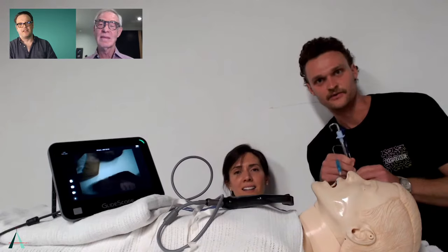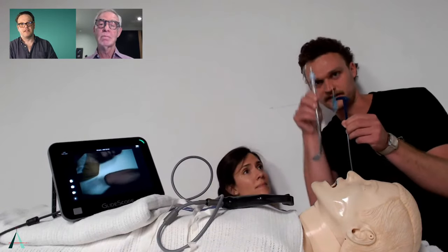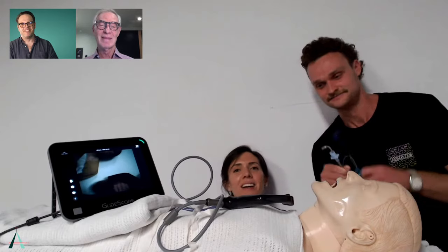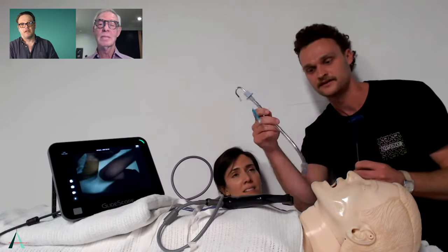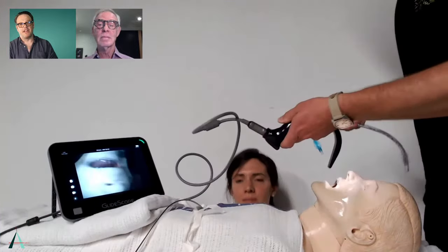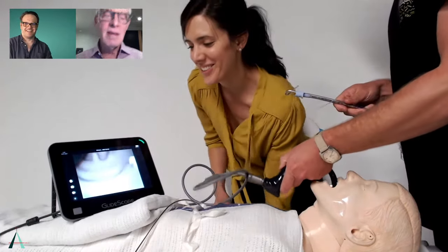No, it's great. It's a different way than what we've been taught at uni. So it's really interesting, coming straight up and then angling back. It's very good. Thank you. Okay. Curtis, do you want to have a crack? Sure. On road we use a malleable stylet, so maybe we'll go with that. That's all right. Yep. Sounds good. Now we're only judging you. Yeah, no worries. Thank you.